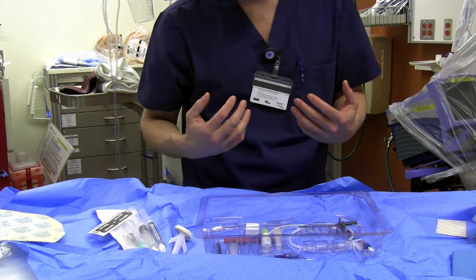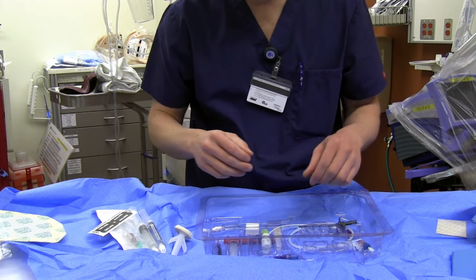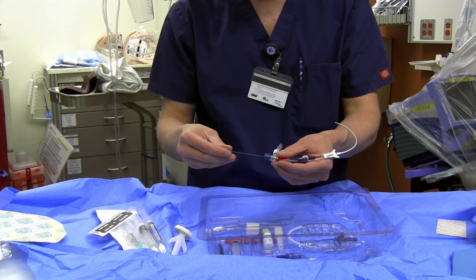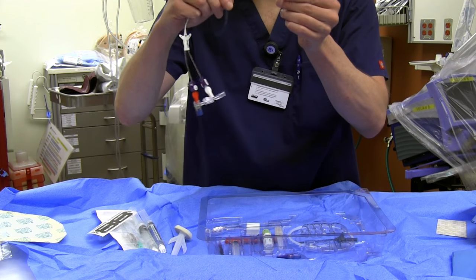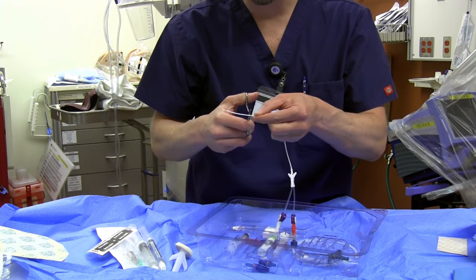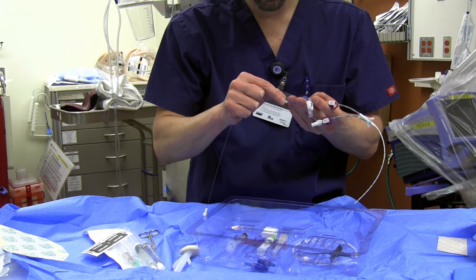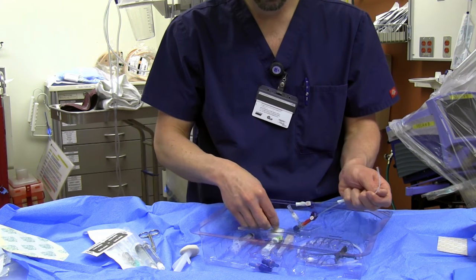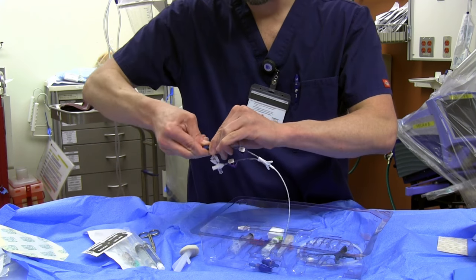So you've got your site, tourniquet on, patient all draped, and you're ready to go. You've done your measurements from wherever your site is to about two centimeters before the arm crease — that's what we found works best. First thing you've got to do is cut your midline. The midline comes with a wire in it, but you can't cut the wire, so you pull the wire back almost or entirely out. Now you look at the centimeter markings on the line, figure out the measurement you've taken, and cut it straight across with the enclosed scissors — let's say we measured 15 cm, here I am cutting at 15. Now put the wire back in through the blue port until it just pops out of your line, then pull it back so it's at least a quarter inch in, and lock that down with the blue knob.